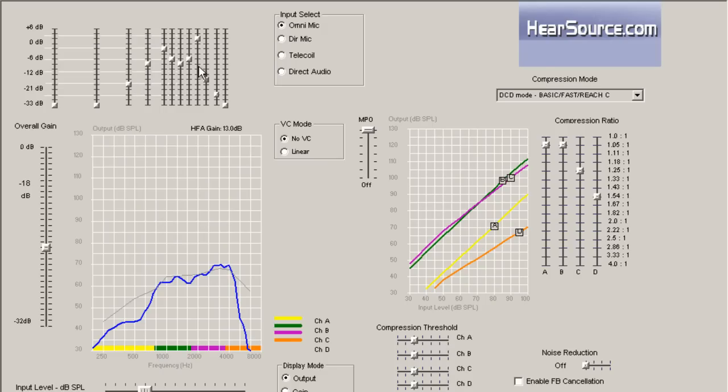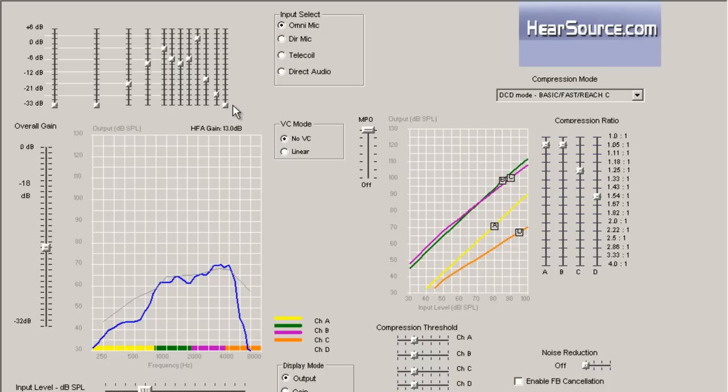And also, with the very highest frequencies at 5.2 kHz, 6.2 kHz, and 7.2 kHz, these frequencies, they're important to hear. I mean, there's a lot of sounds up in that area that you need to hear, but they're less important to speech.